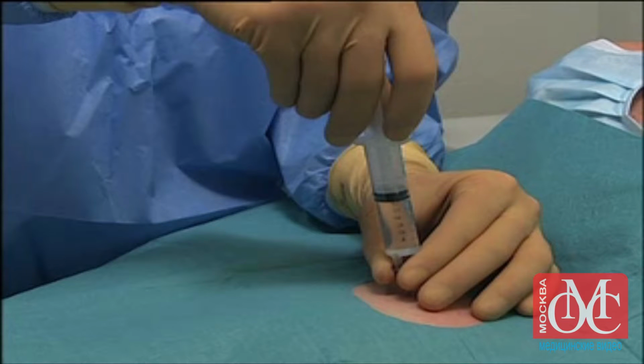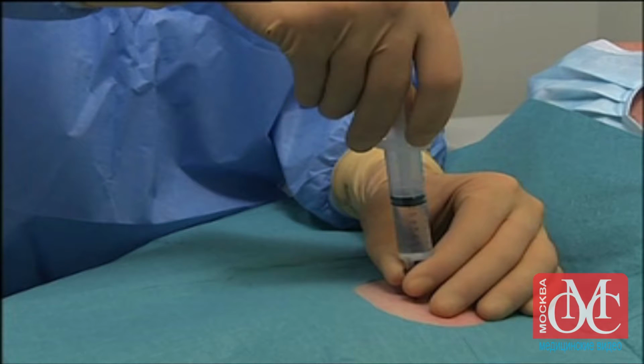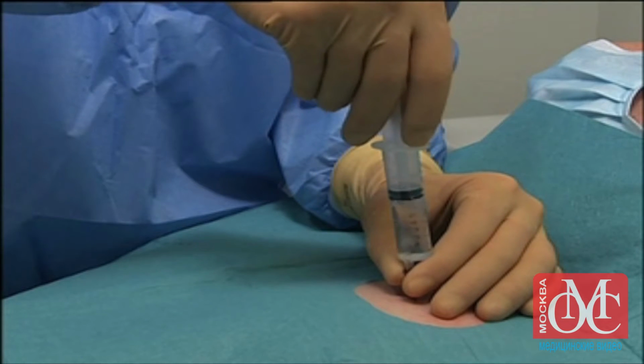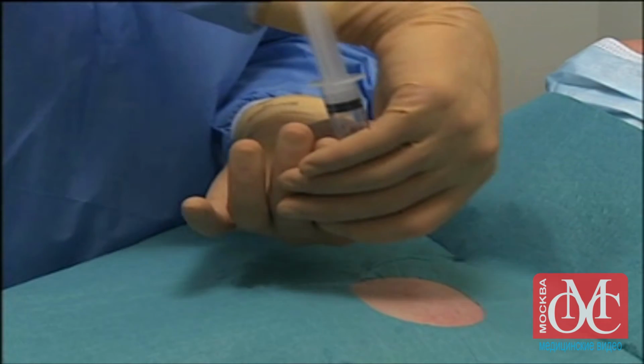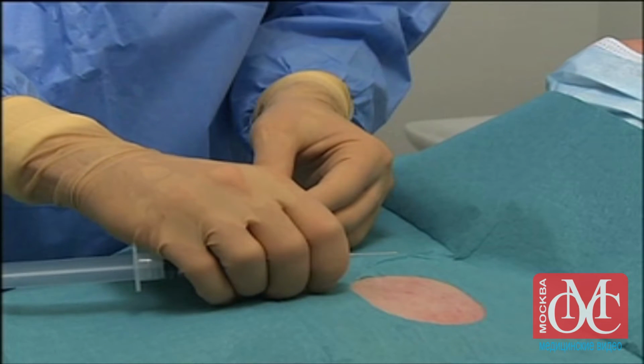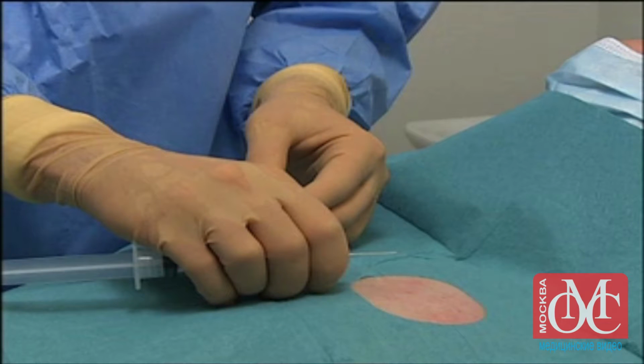Once you have inserted the needle through the intercostal space, continue to aspirate slightly. When you penetrate the pleural space, air bubbles will appear as you aspirate. Before you remove the needle, note the depth of penetration. You will use the depth as a reference point when you insert the over-the-needle catheter.